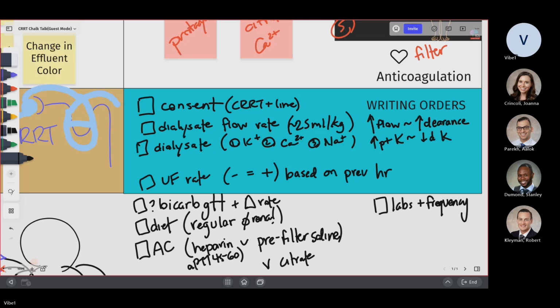Antibiotic dosage, you have to look into UpToDate or literature for the majority, but usually what I feel is, since you're mimicking your normal kidney function, the antibiotics majority of the times are dosed as per your normal kidney function. But there are a lot of guidelines nowadays for antibiotic dosages on CRRT, or you can actually just go look into UpToDate and it will give you the CRRT dosage for a lot of these meds if needed.